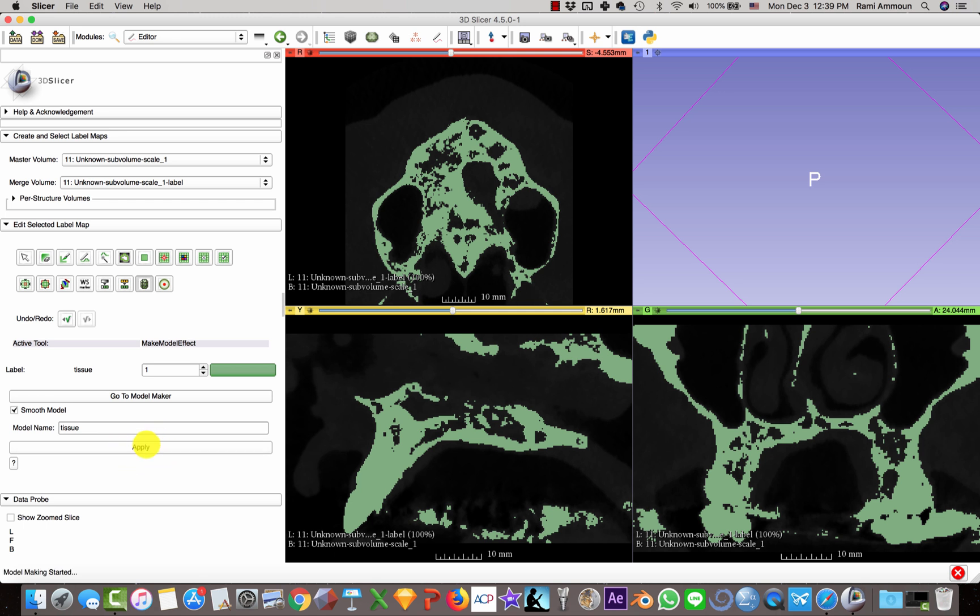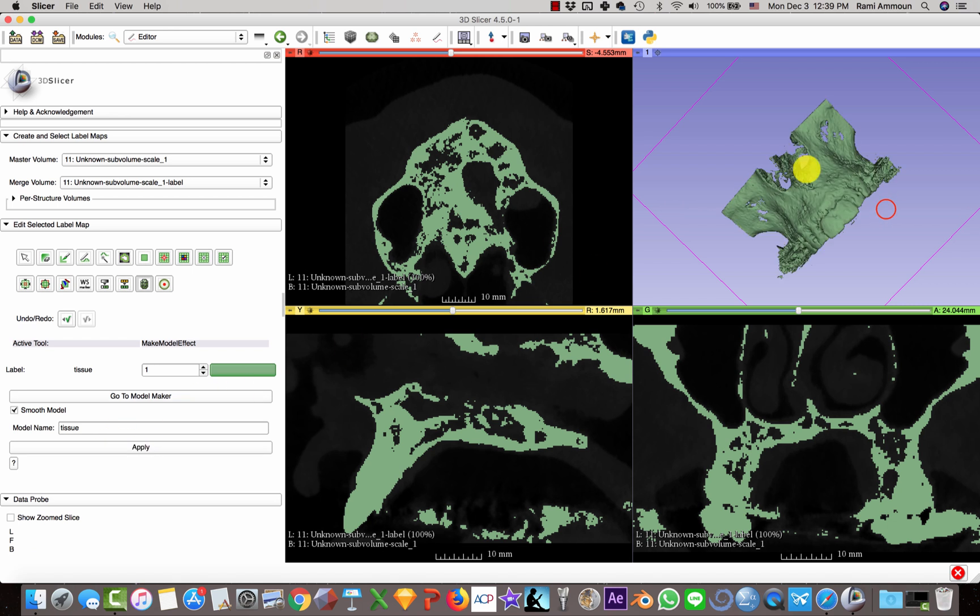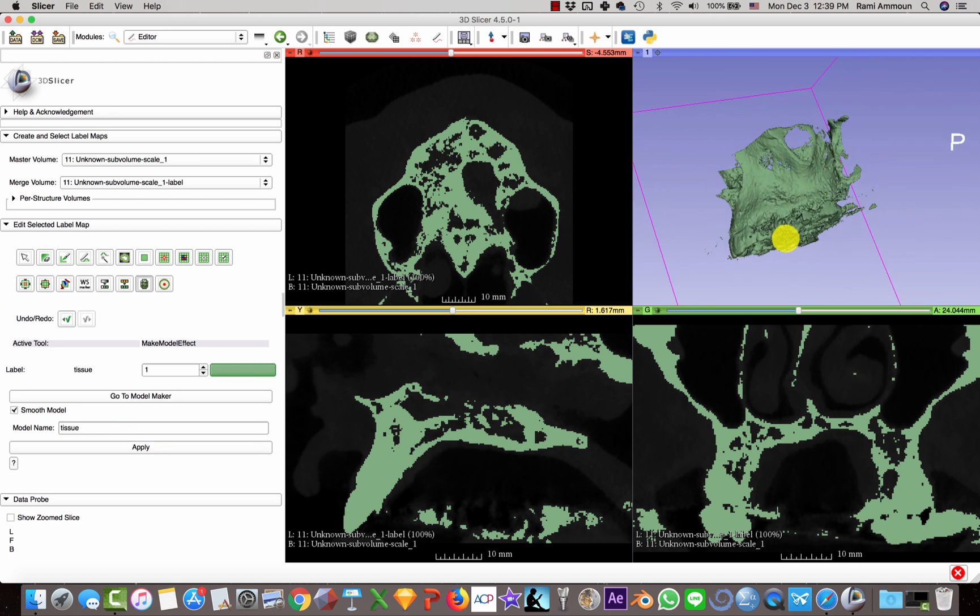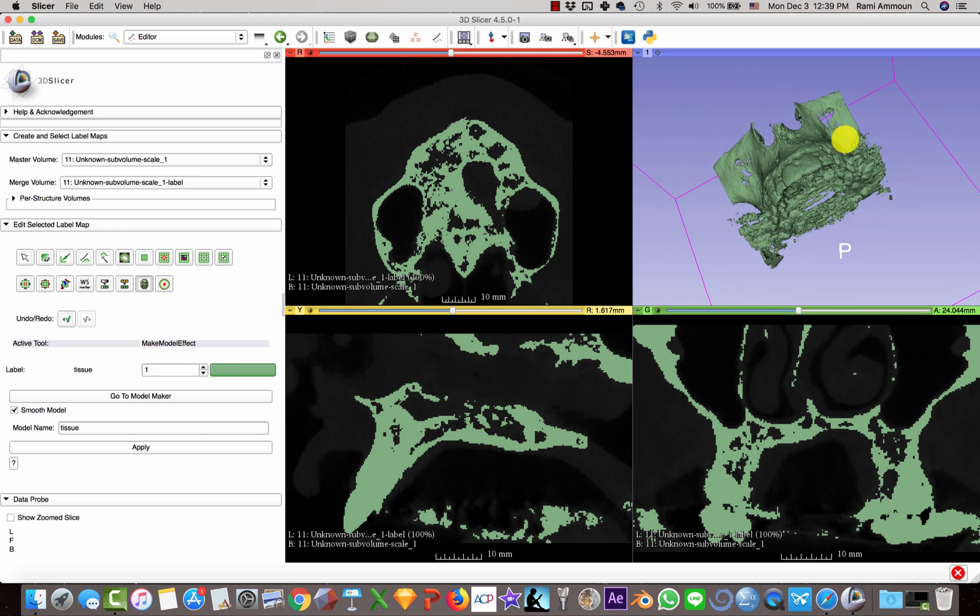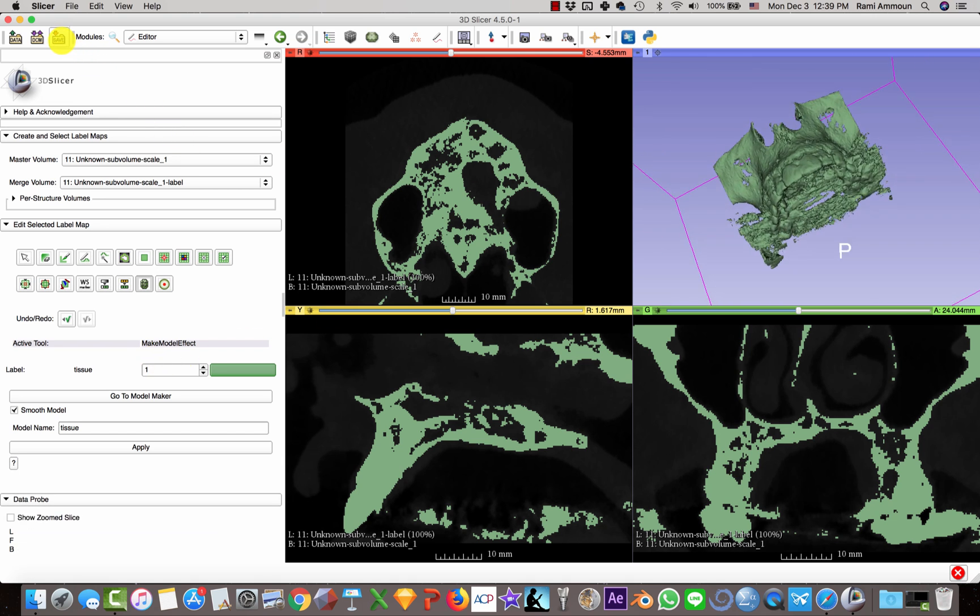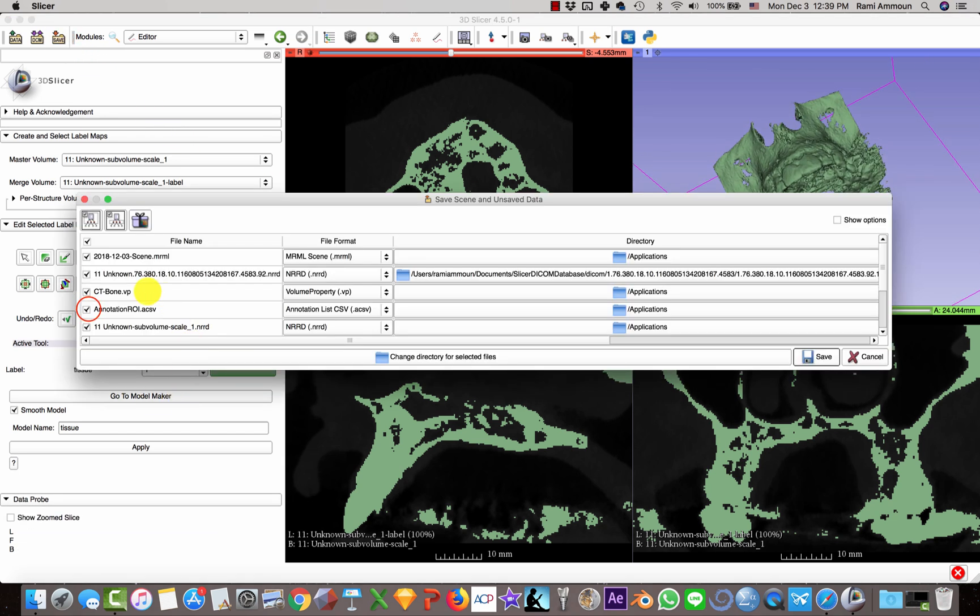You're going to wait a few seconds, and here it is. After that, you're going to click Save. Deselect all of these because you don't need them.